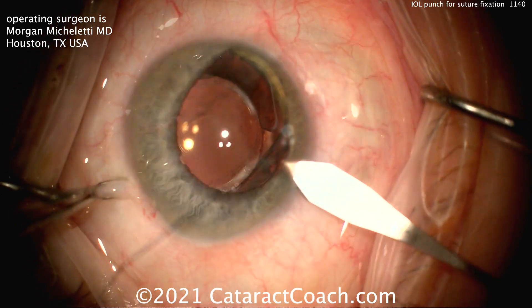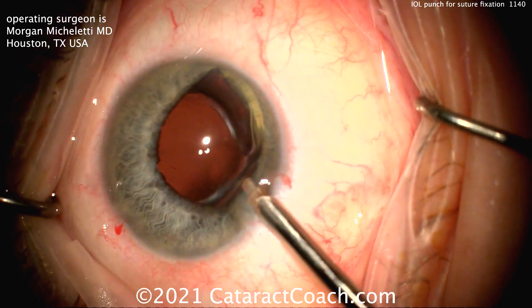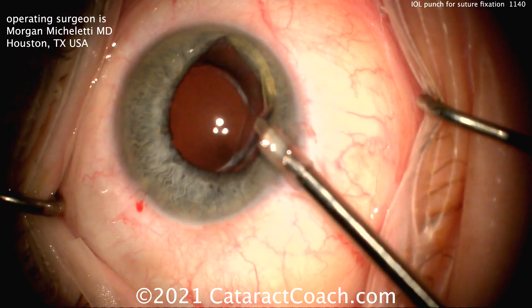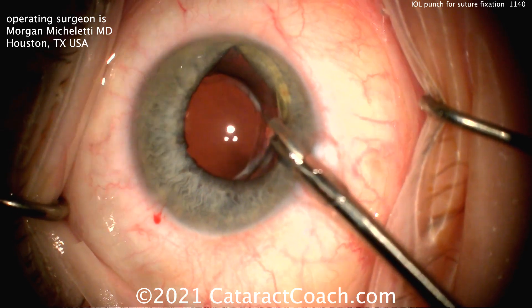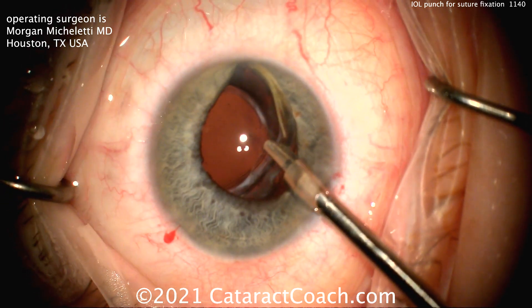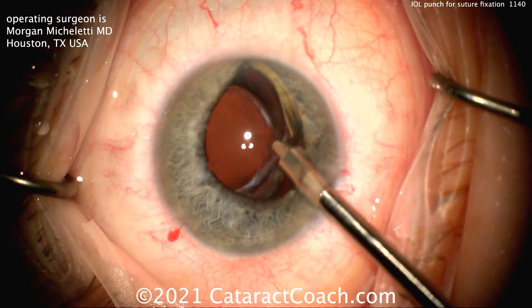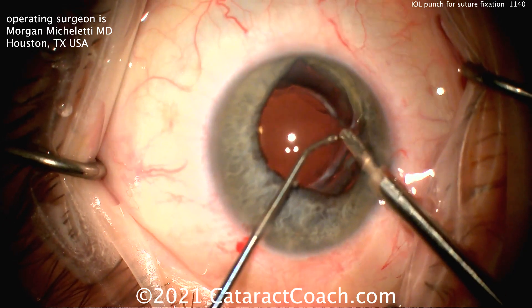Here's a patient with a dislocated lens — you can see one haptic is already above the iris. An incision is being made, going inside the eye, and there's the Eye Well Punch being positioned right at the haptic-optic junction.